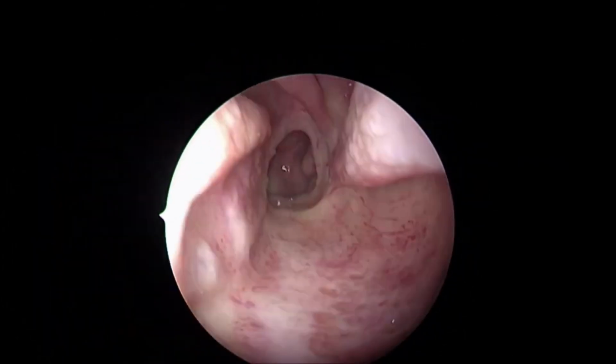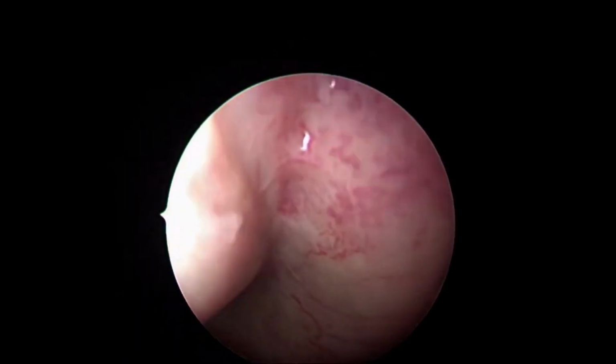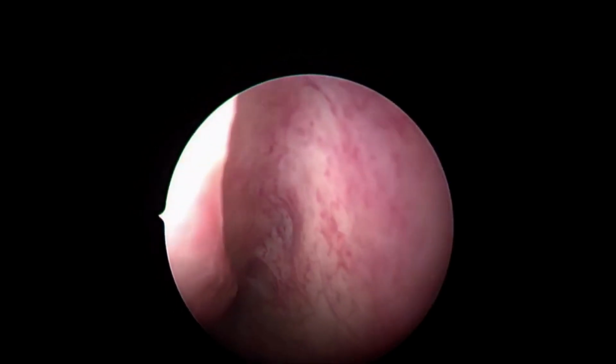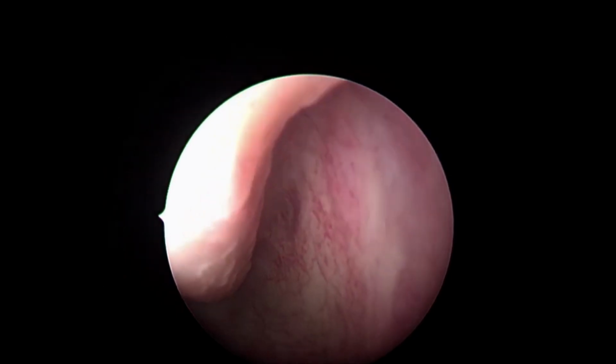Now, underneath this inferior turbinate is an important area. This is the inferior meatus. It hardly contains any important structure except in the anterior part of the roof. I am coming there. Except in the anterior part of the roof, there is, see this?